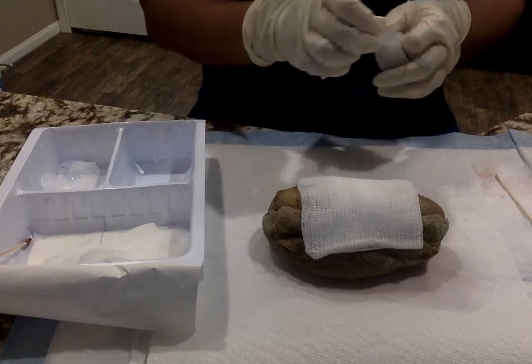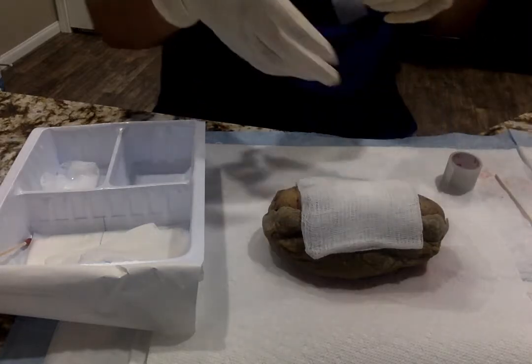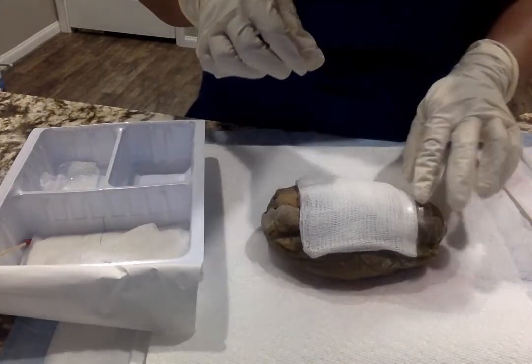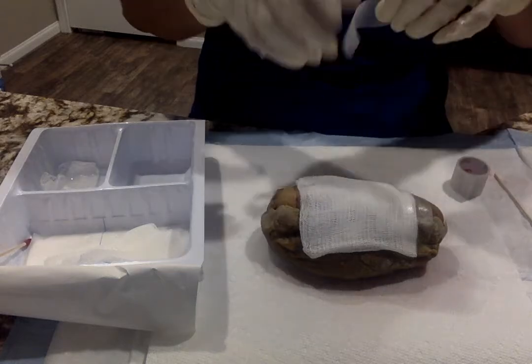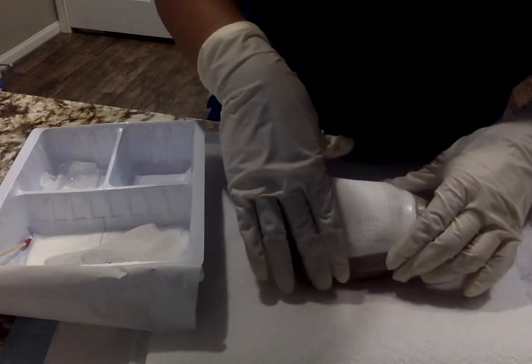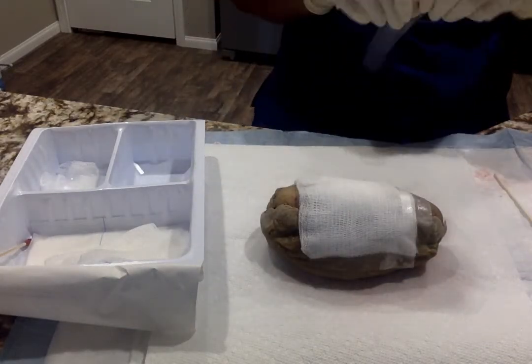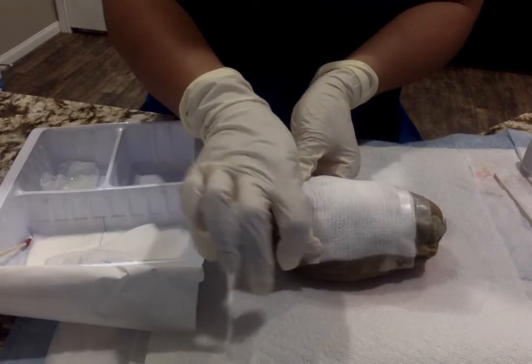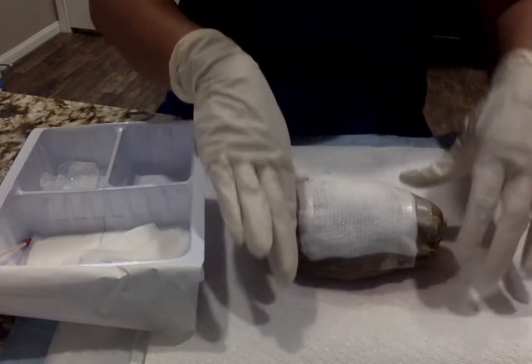I'm just going to make sure that the tape is firmly on the skin and there are no holes. Just patting it down. Again, half on the 4x4 and half on the skin. Okay.